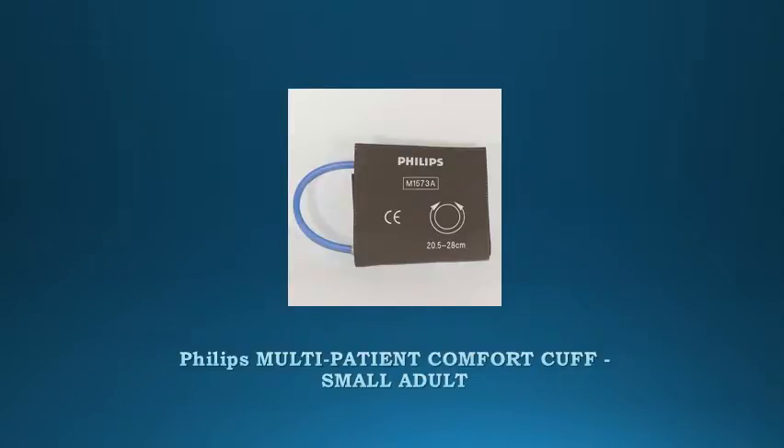Philips Multi Patient Comfort Cuff, Small Adult. Multi Patient Reusable Latex Free NIBP Comfort Cuff for Pediatric Size Patients.